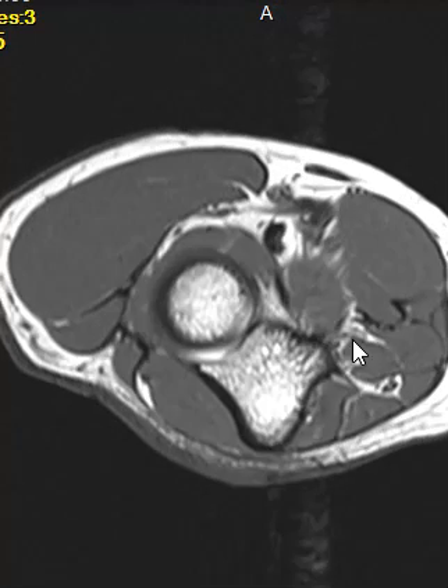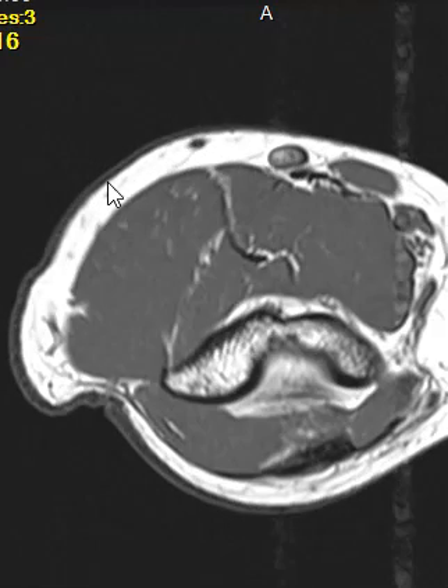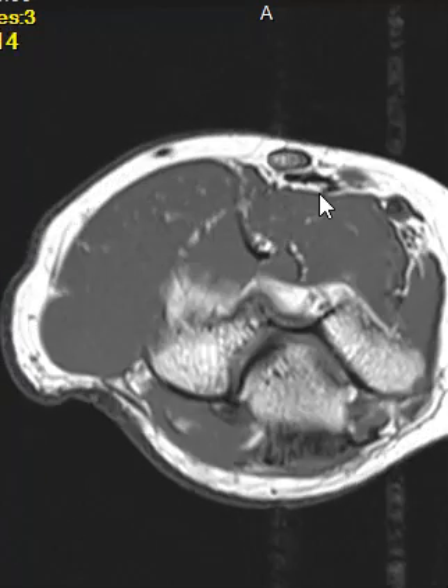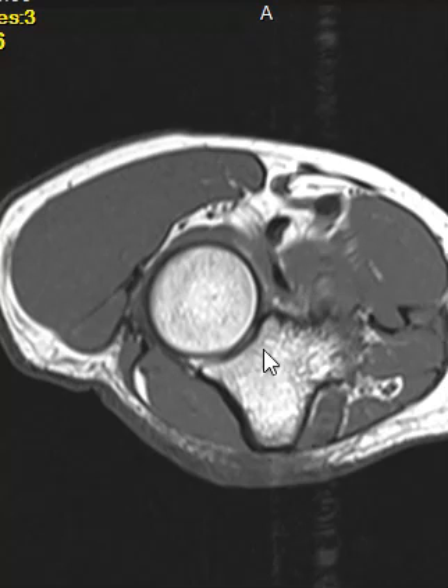I'm going to start with a view here. We're looking in the short axis. This is high up in the arm — just the arm — you see all these big arm muscles. And we're coming down. There's something up here in the very front, this little black line, as your biceps tendon is coming down. We're going to watch it attach on this little round bone here.